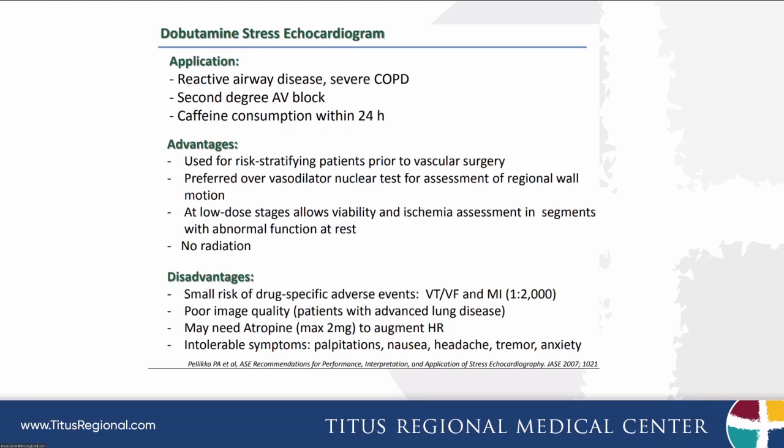The disadvantages are that the medication itself, dobutamine, can have some serious side effects. They're very small in terms of the incidence, but they do happen, and you have to be vigilant for this. And that's why someone with ACLS training needs to be watching these patients at all times during the procedure to make sure that if problems do develop, we can treat them promptly. Again, the other limitation to echocardiography in general for stress testing would be the ability to get good images and having a very experienced sonographer able to obtain those images in a very short period of time while the heart is maximally stressed.